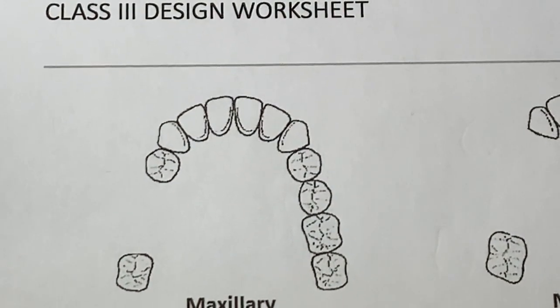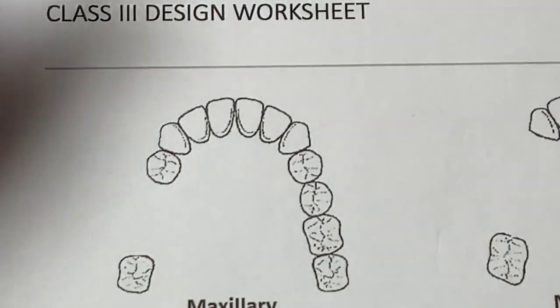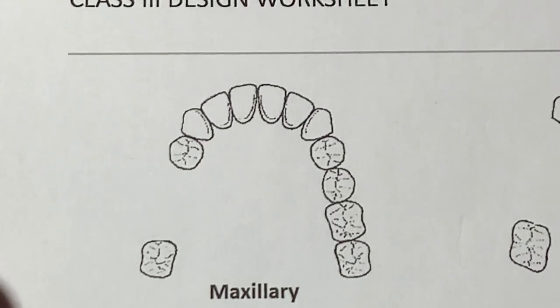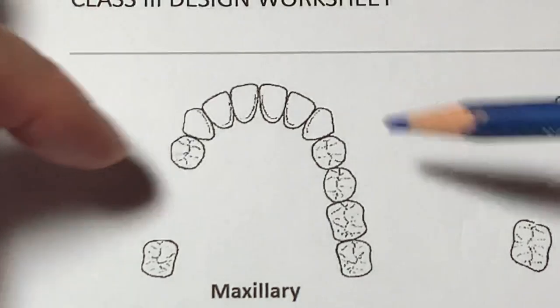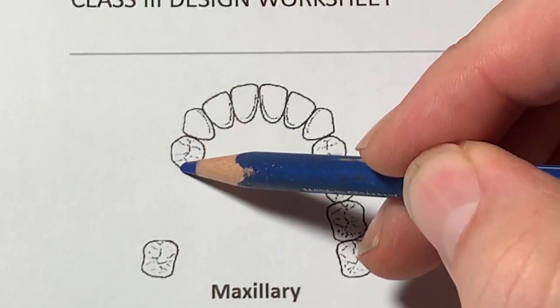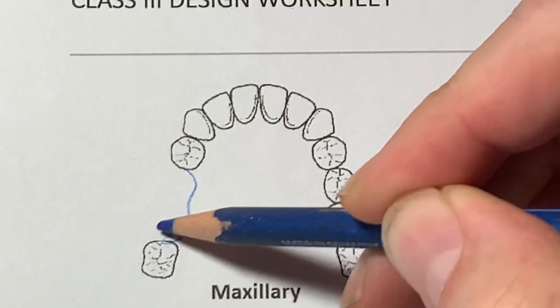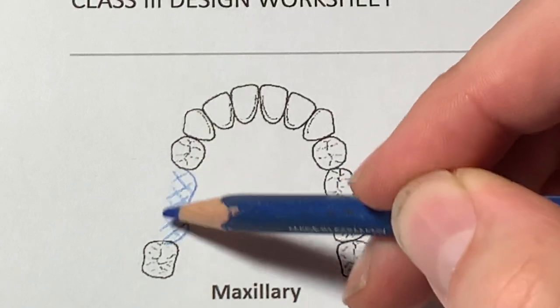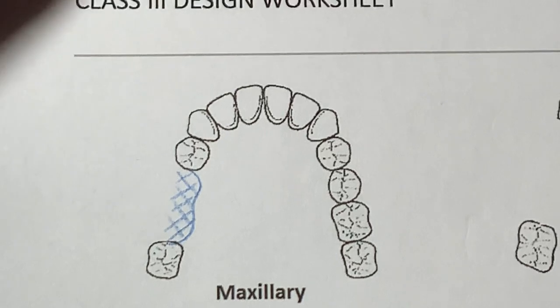We have the Kennedy Class 3 design worksheet, and we're going to go over the steps of design briefly without any clinical instructions. We're assuming all the undercuts are in the classic positions here. Step one is to outline the edentulous area and adhere those prosthetic teeth to the denture base, the acrylic denture base, to the metal framework with this mesh lattice retention.